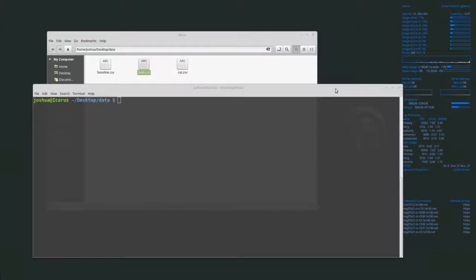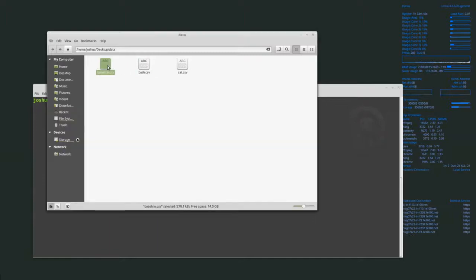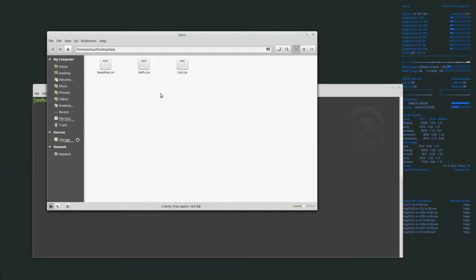Welcome back everyone. Today I'm going to show you how to get Emotive data into Weka for analysis. We have two Emotive data files: baseline.csv and cat.csv. This was a person looking at a cat and we recorded their responses, while the baseline is a person just looking at a white screen.